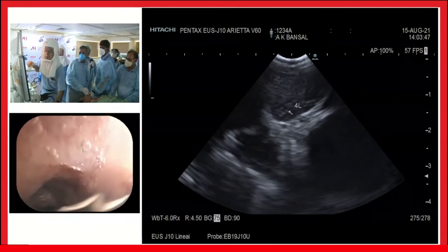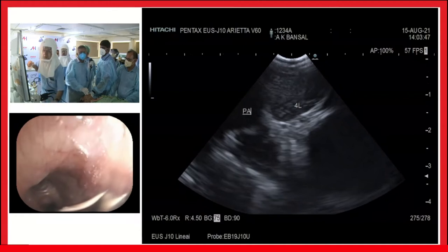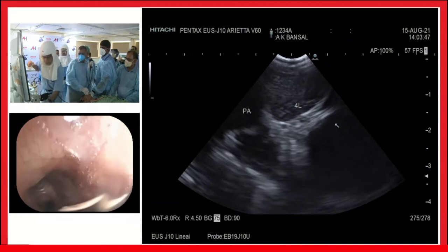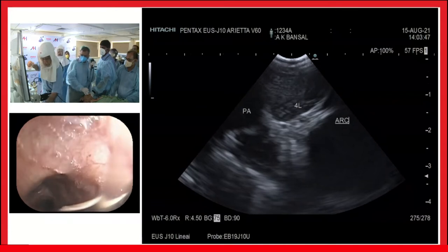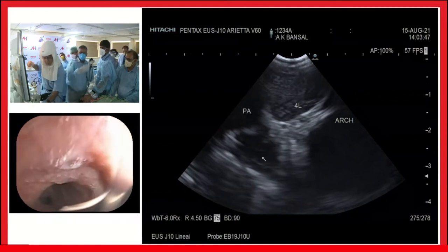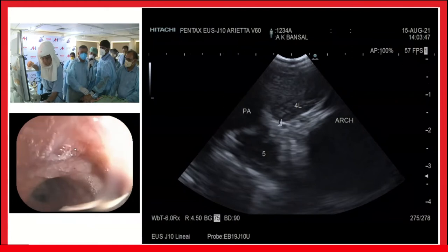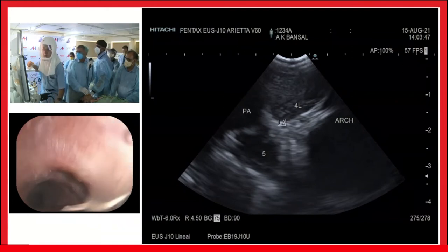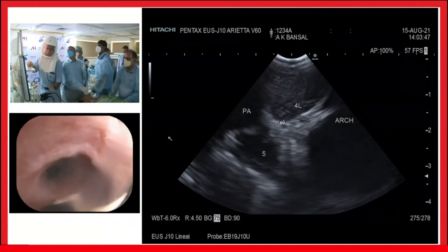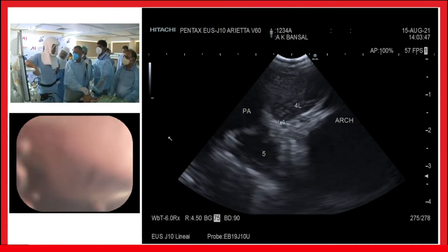So I will show it. That is the 4L lymph node. That is the pulmonary artery on the left, and the one on the right side at about the 3 o'clock position is the aorta. So the pulmonary artery and the arch of the aorta actually look like the ears of Mickey Mouse, and the 4L will constitute the nose. So that's really the Mickey Mouse sign. So you agree this is the ligamentum arteriosum? Yes, sir.